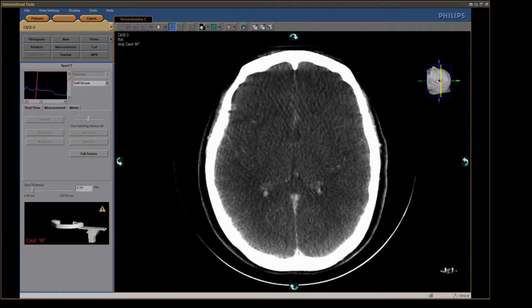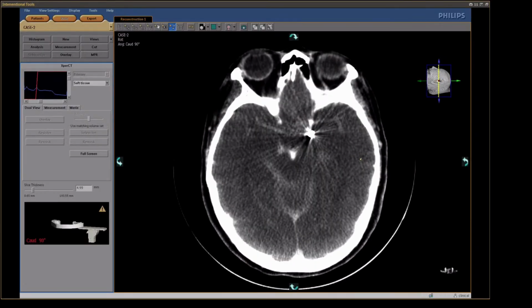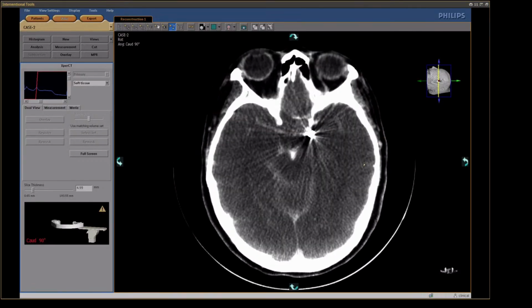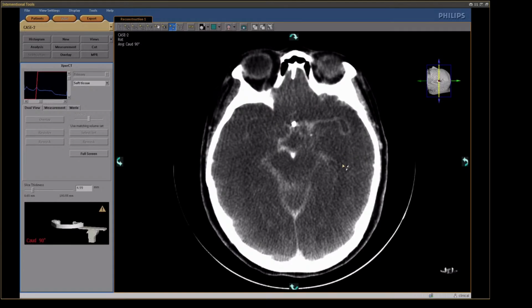If it's needed, we can do CT in 2 hours. But I think it will be clear. Now the 30 minutes left after initial bleeding, and yes, the bleeding stopped, and we asked the anesthesiology team to keep the patient 2 hours in general anesthesia and then extubate. Okay, thank you. See you in 20 minutes. Intracranial stenosis next.